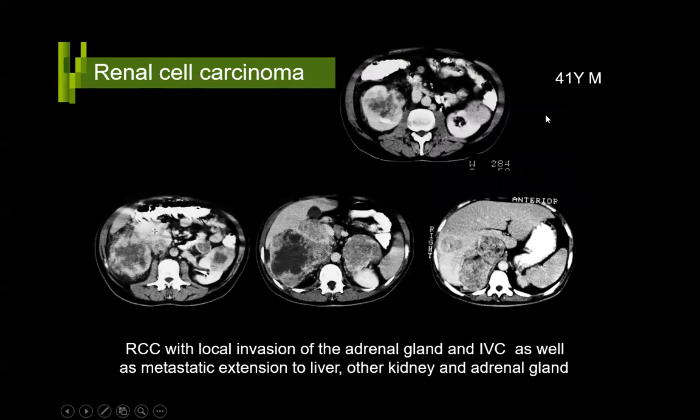Let's see another example. This is a 41-year-old. The patient has a tumor in the right kidney. It's quite a large kidney because of this tumor. This part is not taking up contrast. The rest of the lesion is taking up heterogeneous contrast.